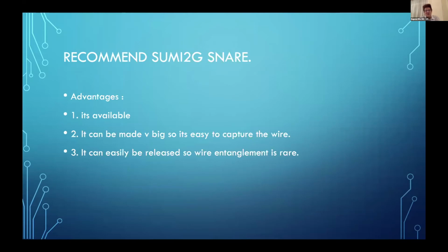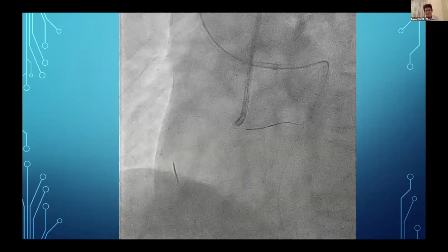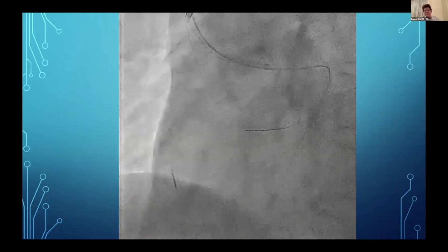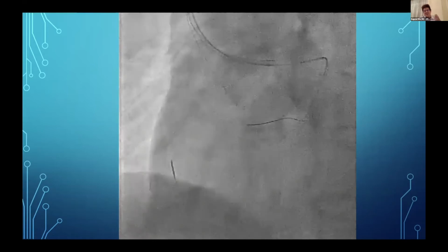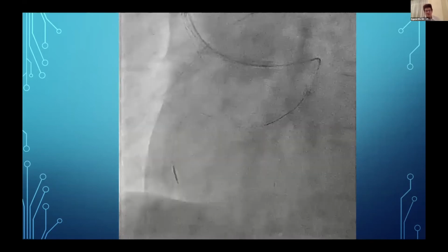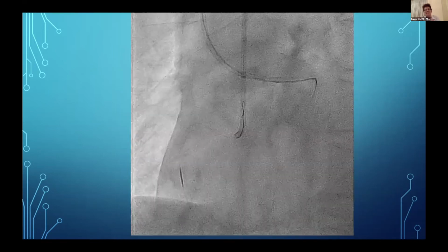So this is a case where you can see how big you can make the loop. And basically, it's quite easy to make the loop. What you do is you just push out the wire from your trapped Corsair. You can see such a big loop. And then if you pull back your retrograde wire and just push it forward, because you've got such a big loop, it's going to capture the retrograde wire. And then you just snare it back up and you can actually capture the wire easily. And this is a very good advantage of having a flexible sized loop. Here's captured and here's pulling it into the guiding. And I usually only put it a little bit into the guiding and then I release it so that I don't buckle the wire too much and end up trapping it.